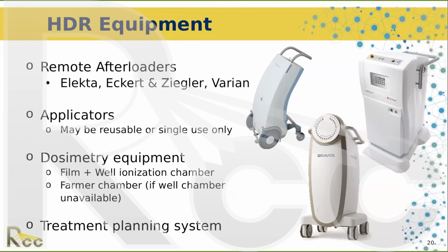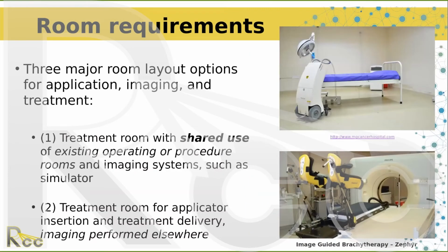I didn't highlight it back here on the second one. This table on the left is one I just like highlighting. It's like an air hockey table. You can see the hose in the back by the CT. This lifts it so that it's a smooth transition to slide the patient from the insertion table to the imaging table. Things like this, and I think people have built their own, are really useful, especially when you've got that applicator in the patient.